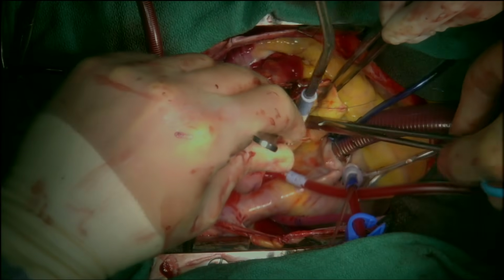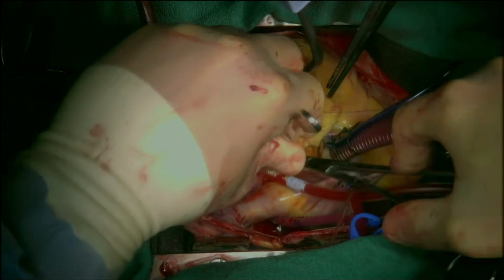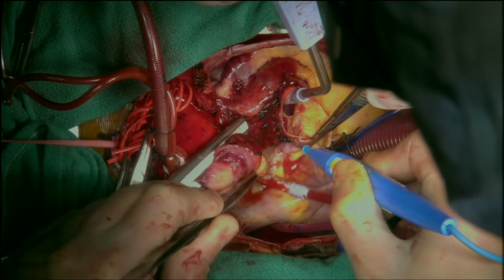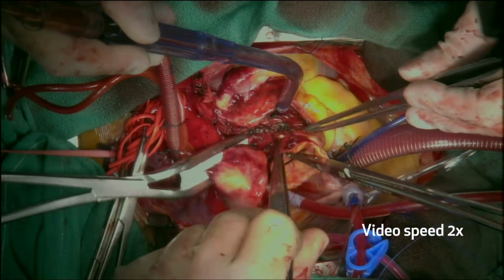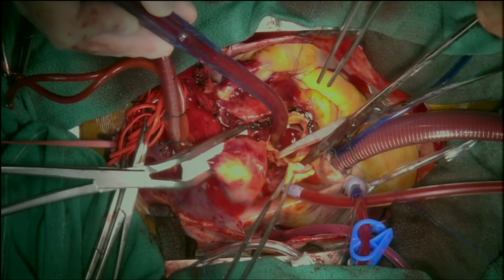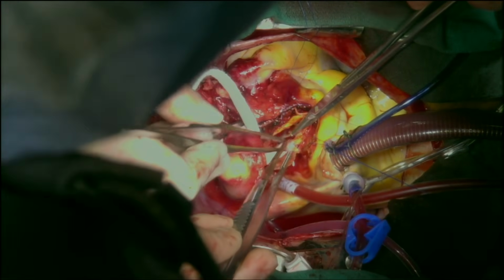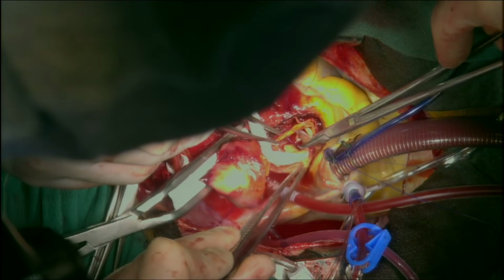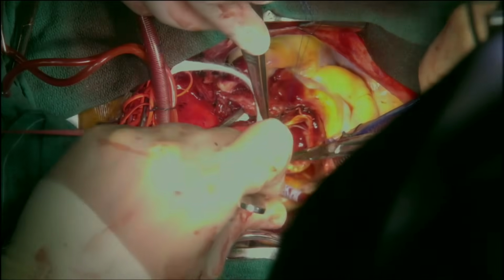Pledgeted Prolene sutures were used to resuspend the commissures. The root was further dissected circumferentially. The aorta was further transected down to the level of the sinotubular junction. There was extension of the dissection to all 3 sinuses without involvement of the coronary ostia. The root tissue quality was appropriate. The aortic valve was tri-leaflet. The leaflets appeared grossly normal without significant thickening or calcification.